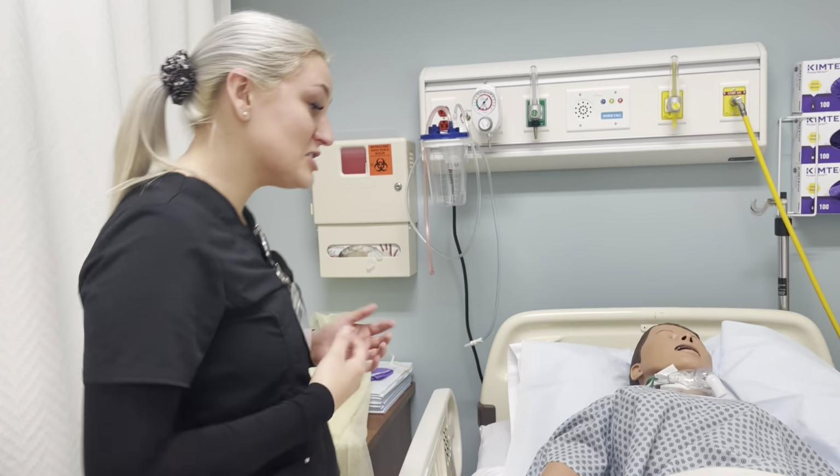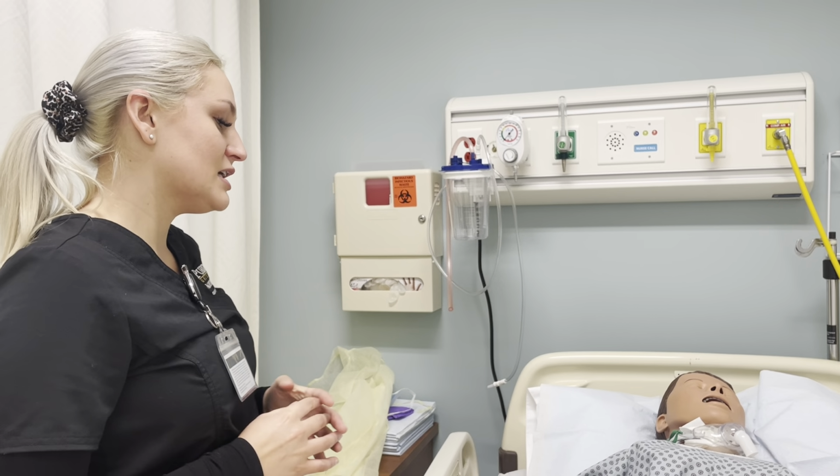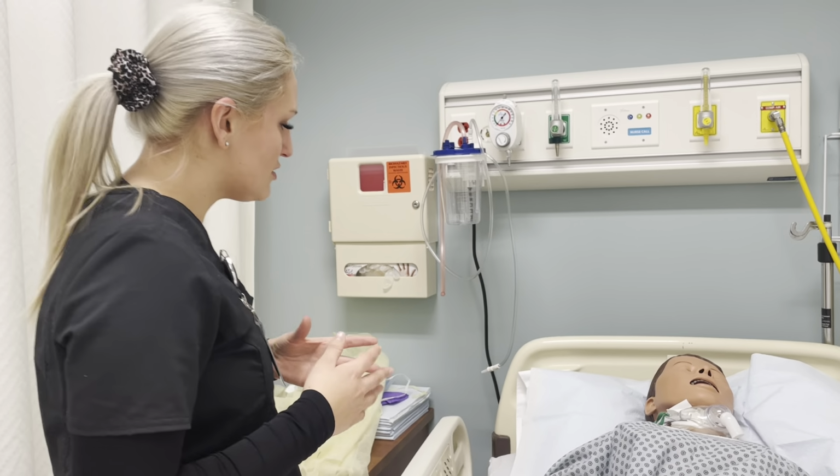Hi, Mrs. Alvarez. My name is Jamie. I'm going to be your nurse today. I reviewed your records, and it shows that you are due for a dressing change for your wound. Is it okay if I go ahead and do that?